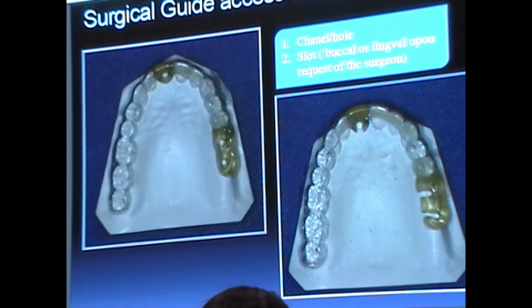So there's more than one way to do this. You could just utilize, rather than an occlusal gingival guide, a lingual approach. And that's just something so that the surgeon at least has an idea of where the implant needs to go, but they are limited by their movement. There's only one way that they can do this. If you have too much play in a buccolingual or mesial or distal fashion, and they end up placing the implant in that manner, now we have a problem.